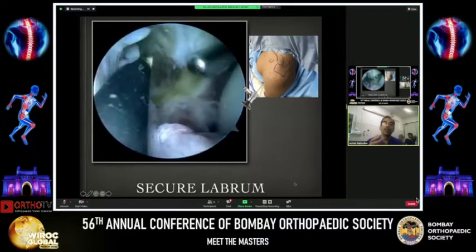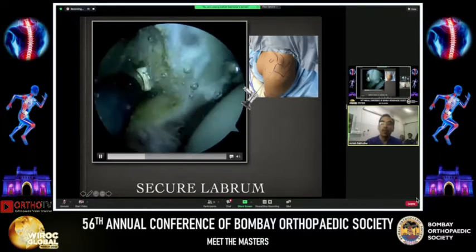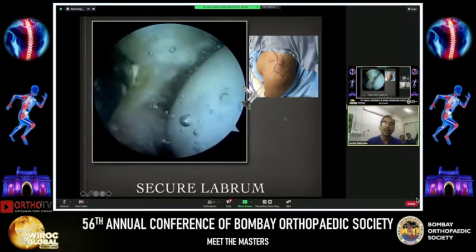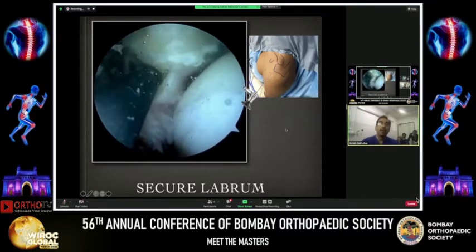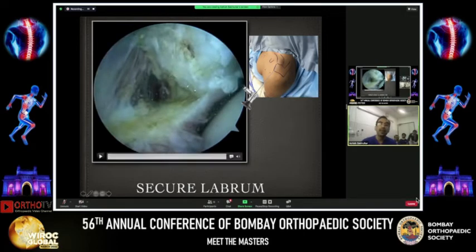I have eliminated the diagnostic round to include maximum steps in the 20 minutes we are doing now. We have switched the scope into the anterolateral portal and we are doing the left shoulder. I have shown a sketch of the position of the scope and the surface markings. My radiofrequency is coming in from the inferior portal. I have cleared the anterior glenoid, maintained the labrum and detached it right up to the six o'clock position, to preserve it and do a Bankart repair at the end of the procedure.